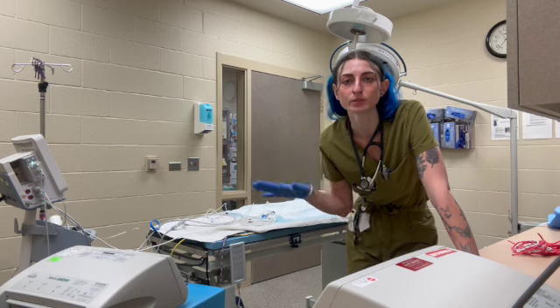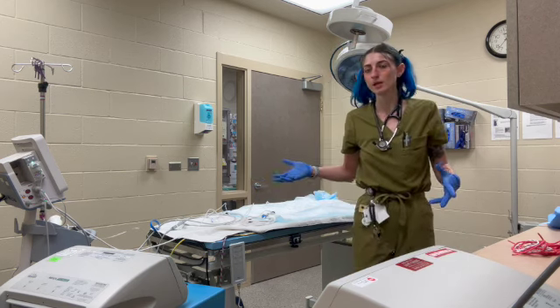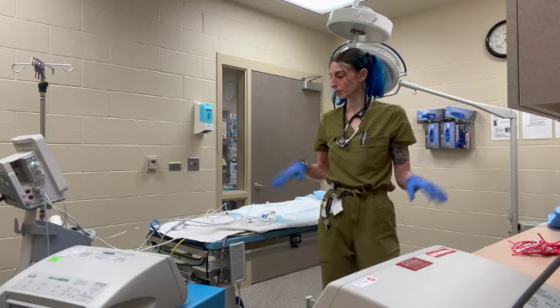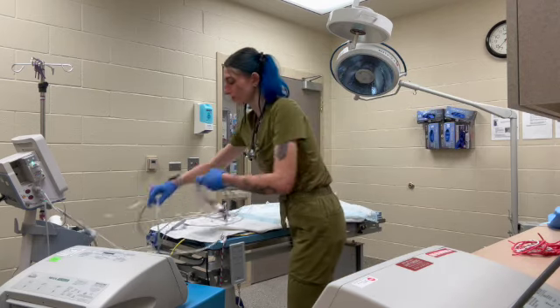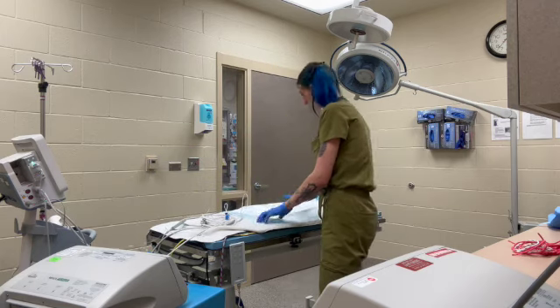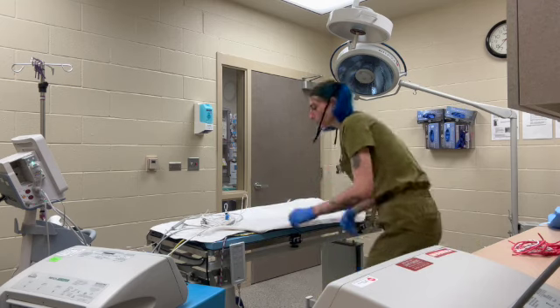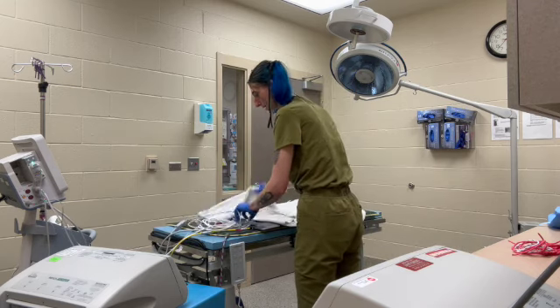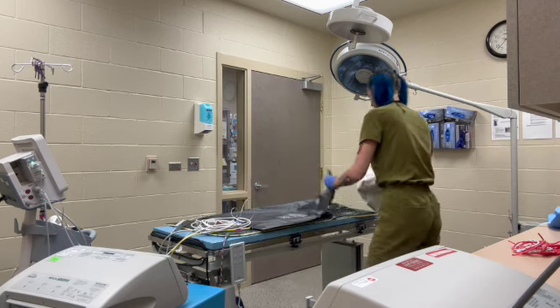This surgery team just finished up with a patient, so I'm just going to demonstrate how we clean our ORs after they are finished. I will start by getting rid of all of the bodily fluids, so all of our potty pads and stuff I'll throw in the bins, and the blankets and things we have hampers for, so I will put that in a separate hamper.